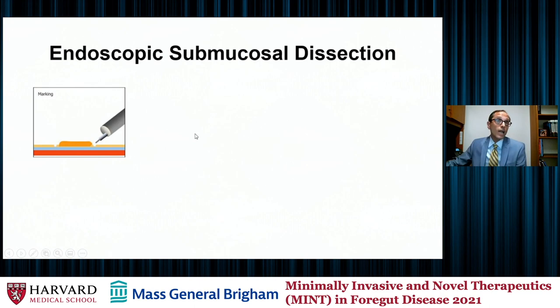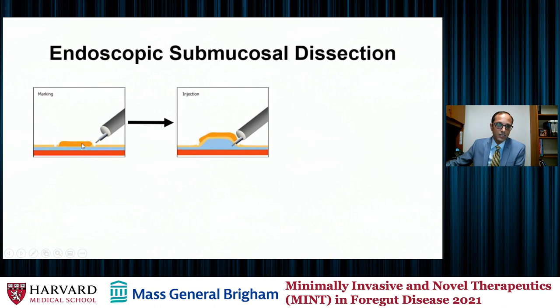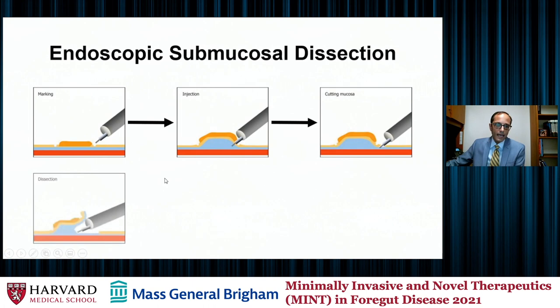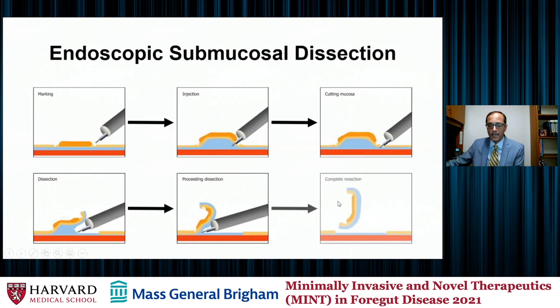Sometimes lesions are too big to get a good en-bloc resection, and in this situation we can consider endoscopic submucosal dissection (ESD). First, we mark the lesion — placing marks around it — inject a bleb of a lifting agent, and then start dissecting out the lesion from above, continuing the dissection. Finally, as we proceed through, we're able to get an en-bloc resection with clear margins.